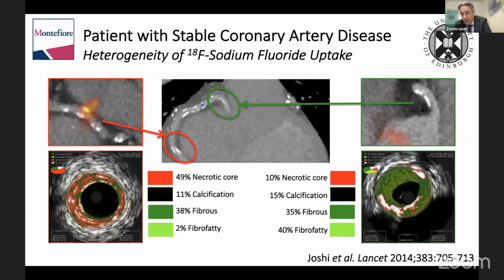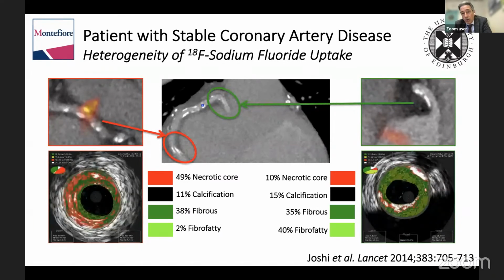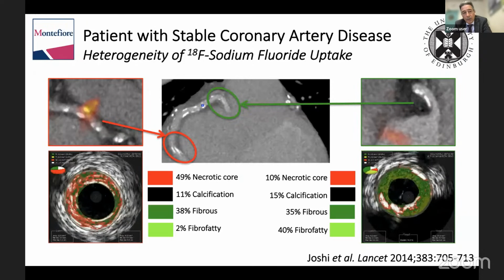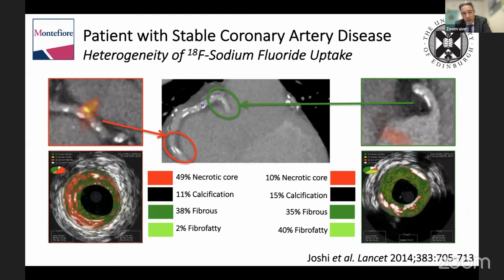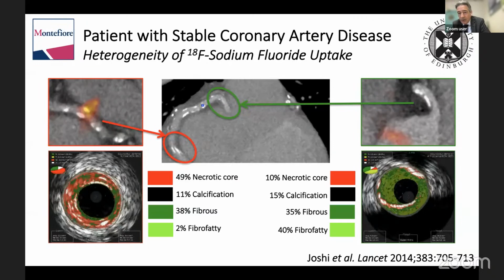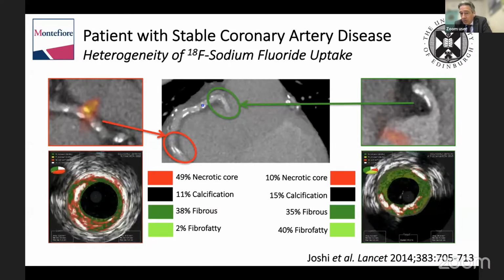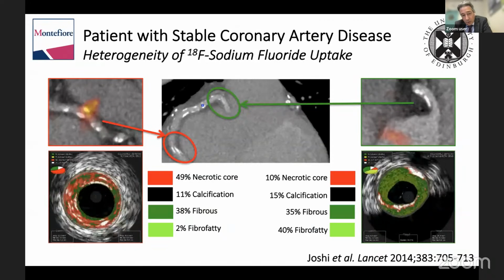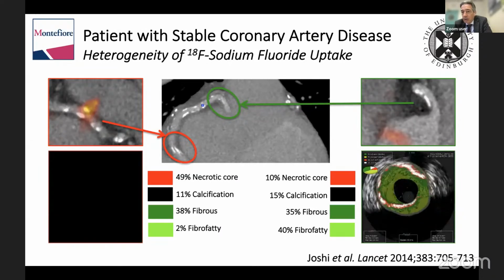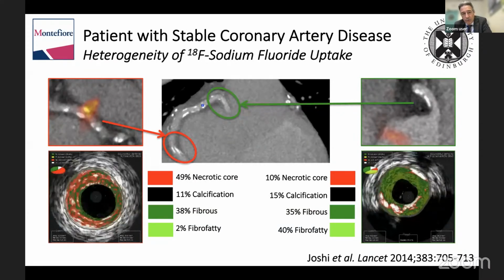And indeed, when we looked in the stable patients, we saw the same thing. So this is a CT of a patient's right coronary artery, and you can see that in the proximal right coronary artery, there's an area of calcification and a little bit of atheroma. And on the mid vessel of the same artery, you can see some sodium fluoride uptake. And in the virtual histology IVUS, as it tends to be called, the IVUS images of those two plaques, you can see on the right there's a lot of white and not a lot of red, and on the left a lot of red as well as some white, the red being a necrotic core type plaque. So really it does seem that sodium fluoride is telling you about the more necrotic core that's actively calcifying because it's in danger of rupture.